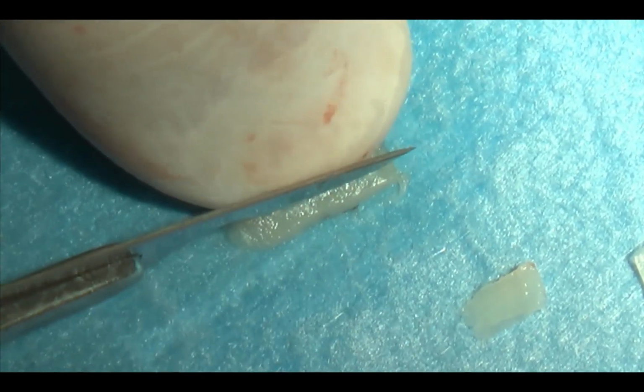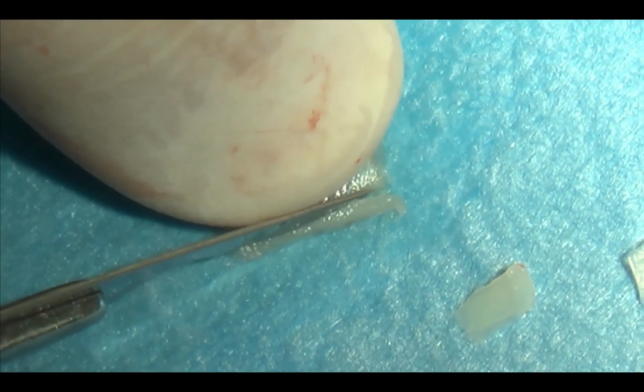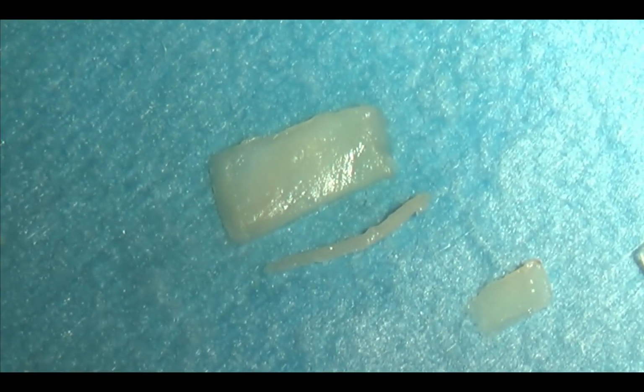And so you keep it firm. You make this very, very sharp incision in order to remove remnants of epithelium.